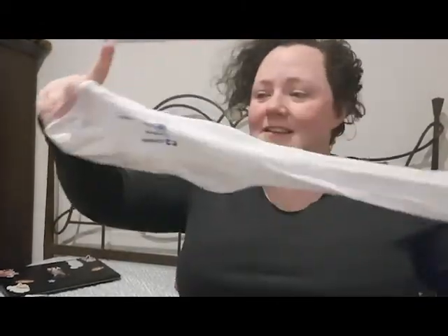Now today I am going to be doing my very first video where I am going to be showing you how to put on a compression sock. This is a particularly long one. This is a thigh-high one, or not really thigh-high, it goes all the way up to literally the very top of your thigh, up to the hip.